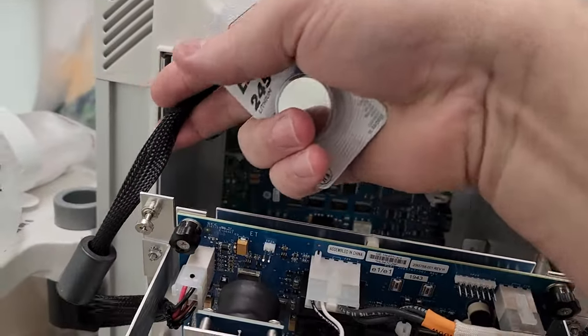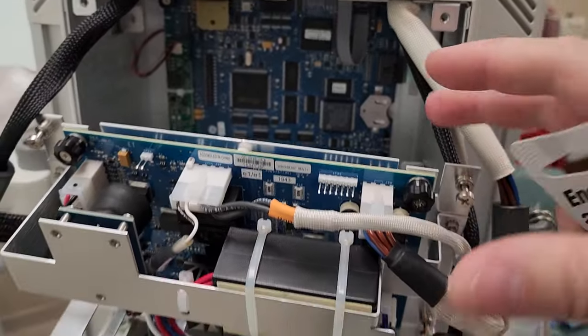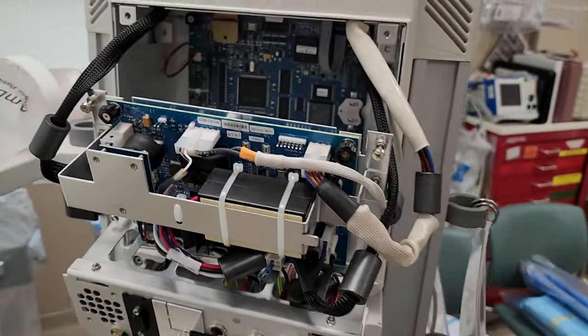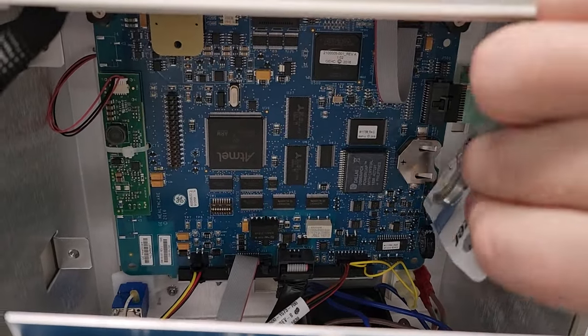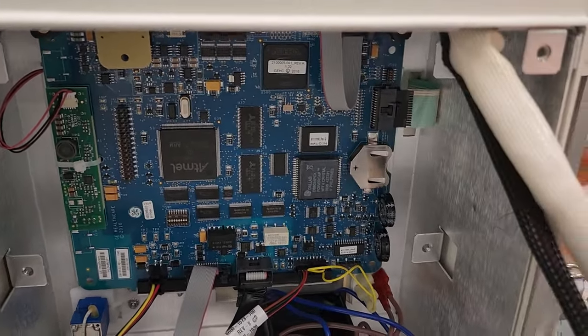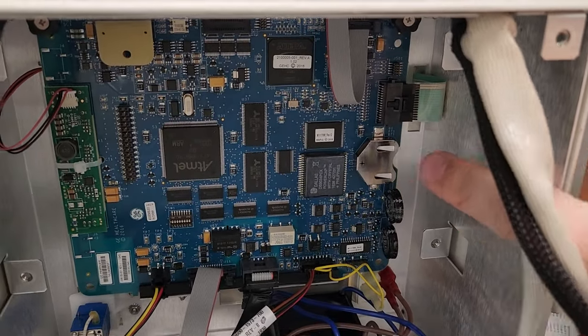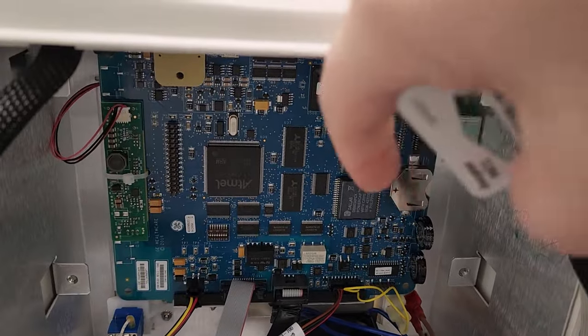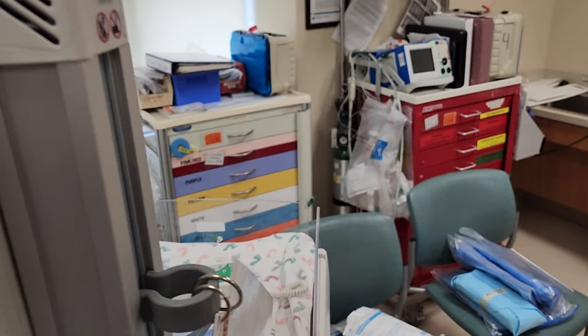And then you gotta watch these cables up here and over here. Just kind of pull them off to the side, and this whole thing will just kind of fall out. And it just dangles, and you don't have to disconnect anything. Right here, you can see the coin cell holder. So you gotta change that out. Just use a little piece of plastic from this side, push the battery off to the side, comes right out, and there you go.